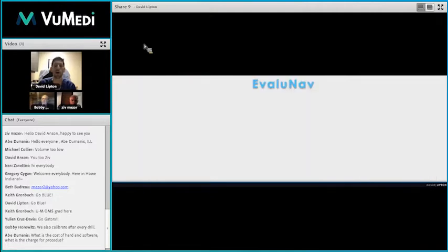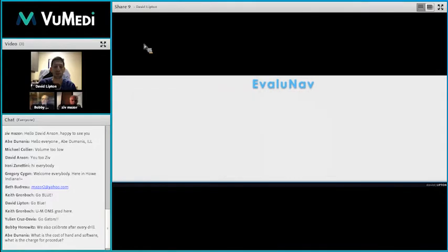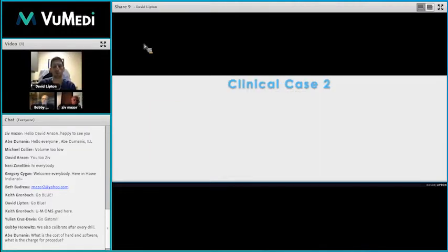Well, within the software, our patients get a postoperative CBCT, and in that postoperative CBCT, we put it into the EvaluNav program, which in this first image shows where the implant is, and the yellow is where it was planned. The red one is where the actual implant was placed. And then the software merges these files and overlays them so you can sort of see where it was planned to where it was placed. But what's really nice is it gives you data. And in this case, we were 0.5 millimeter off at the entry, and we were 0.5 millimeter off at the apex, which to me is more accurate and more precise than what Schneider found in his systematic review using static guides for implant dentistry.